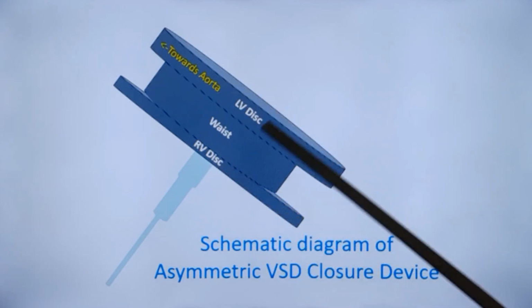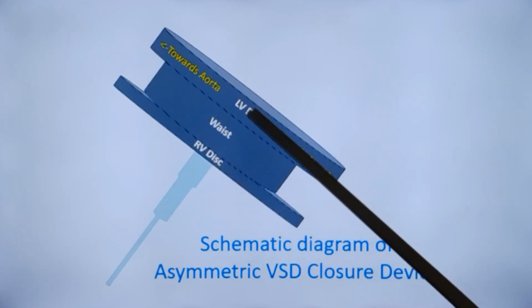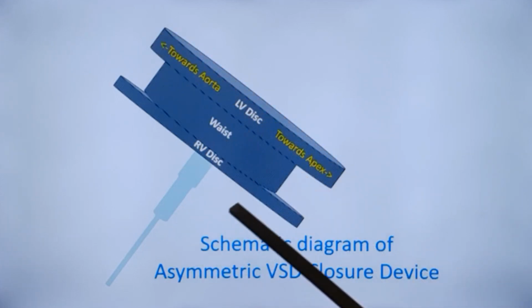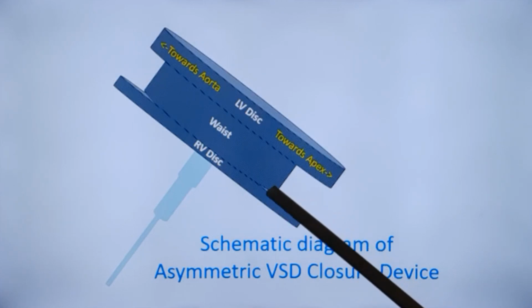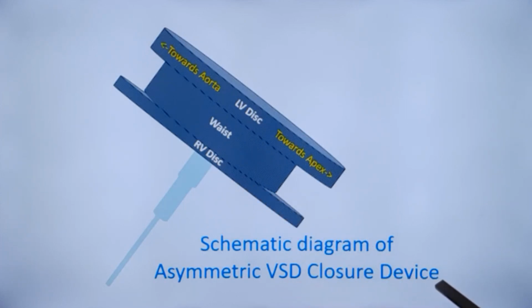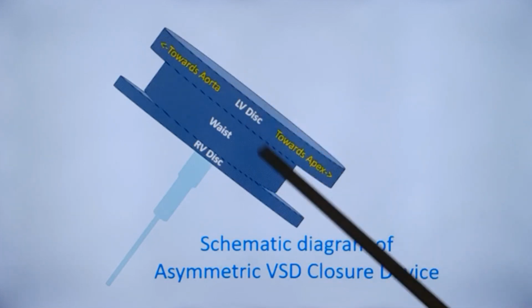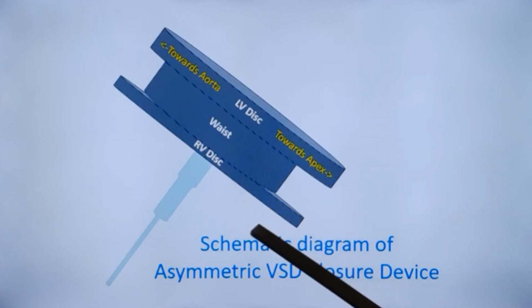This picture or diagram is not on scale, only for explaining the concept. So, as the flange towards the aortic side is lesser, the chance for damage to the aortic valve and the conduction system is lesser for asymmetric VSD closure device. Usually for device closure, devices will have symmetric flanges on either sides. Here it is an asymmetric VSD closure device.